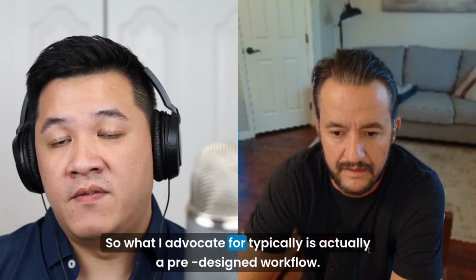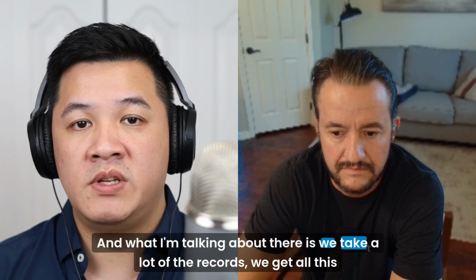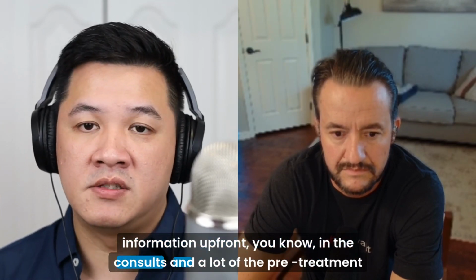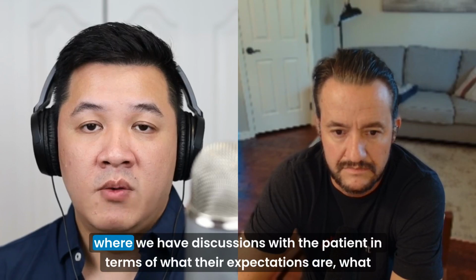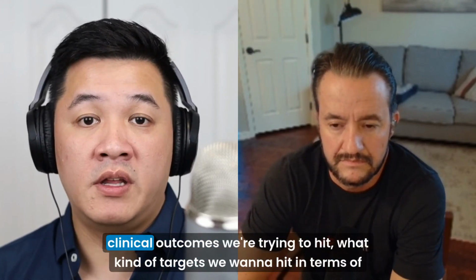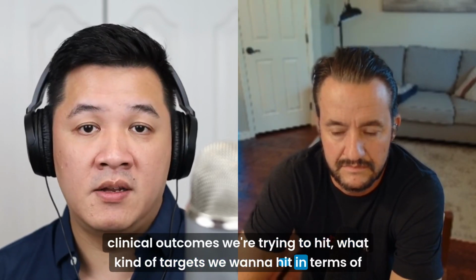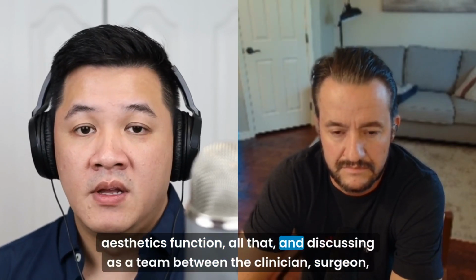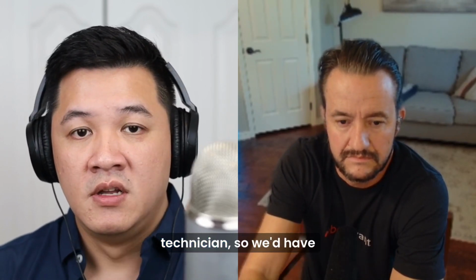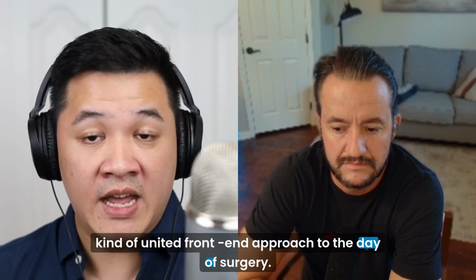So what I typically advocate for is a pre-designed workflow. What I'm talking about is we take a lot of the records and get all this information up front, in the consults and in a lot of the pre-treatment, where we have discussions with the patient about their expectations, what clinical outcomes we're trying to hit, and what targets we want to hit in terms of aesthetics and function. And we discuss it as a team between the clinician, surgeon, and technician, so we have a united front and approach to the day of surgery.